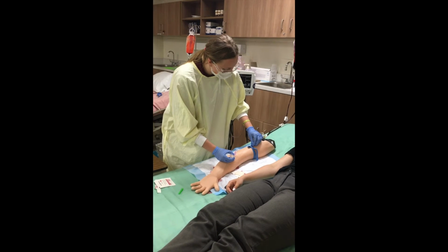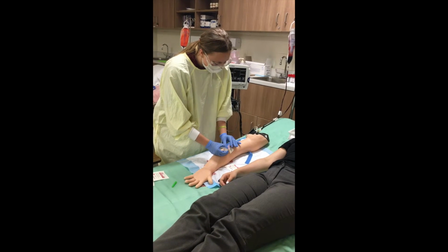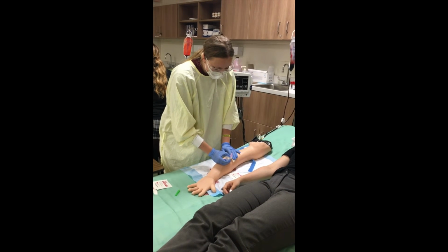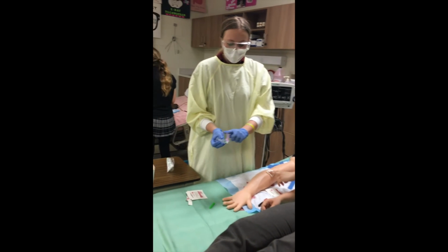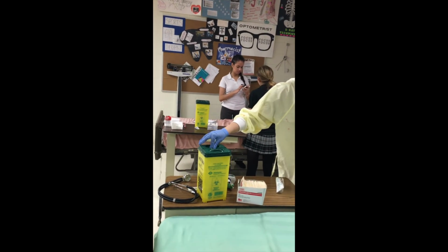You can then take your tourniquet off and get your gauze and hold it over top of the collection area and take the needle out. You can then ask the patient to put their fingers over top to hold down for pressure as you put the safety on top of the vacutainer and put it in the sharps container.